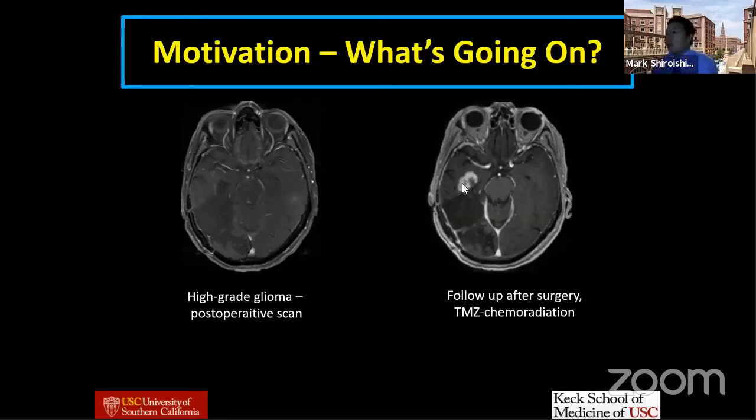There are some older radiologists who believe that if it's very solid, then it's tumor, and if it's more fluffy or not solid, that it's not tumor, and that's post-treatment radiation effect. But there's really no good studies to support that. So we need better techniques to try to hammer this out, and using conventional imaging, just using the contrast enhanced imaging, isn't really the most accurate way. And so we need other methods.